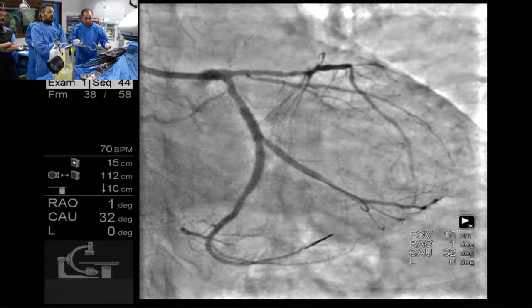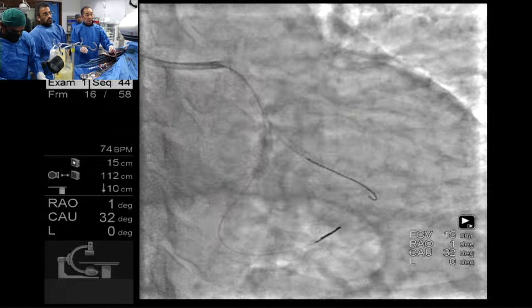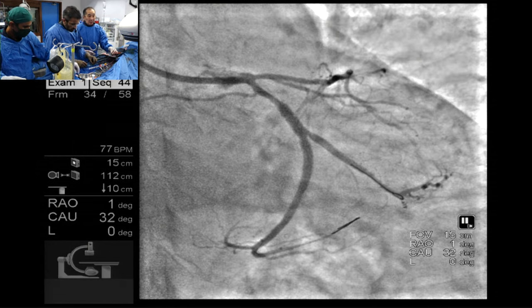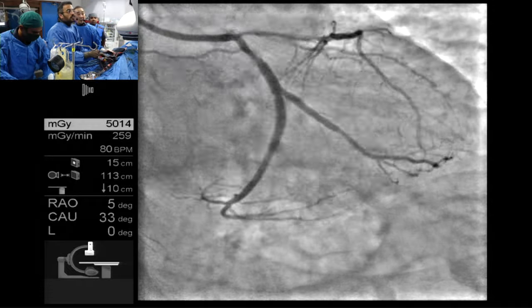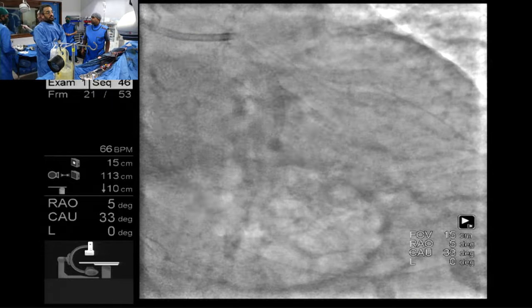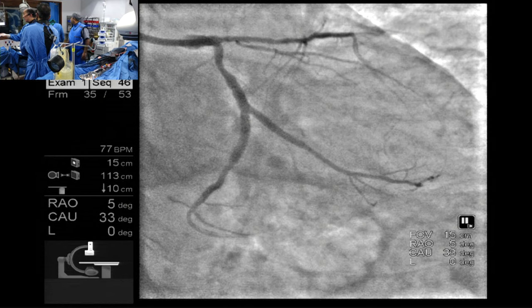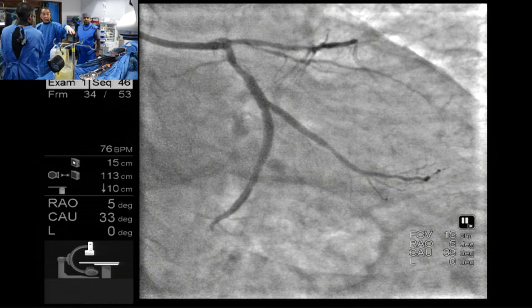Let's IVUS it first and decide. All right, give me an IVUS catheter. Can you go back the other wheel? So that, do we want, no, it's okay. It's okay, beautiful. You want to show them the IVUS after they come back, or you okay? After lunch? So that's IVUS, right? Yeah. After lunch, just show the IVUS. Done, okay, good. And the final picture.